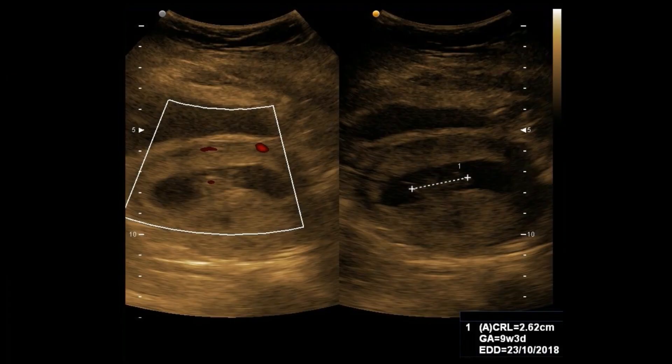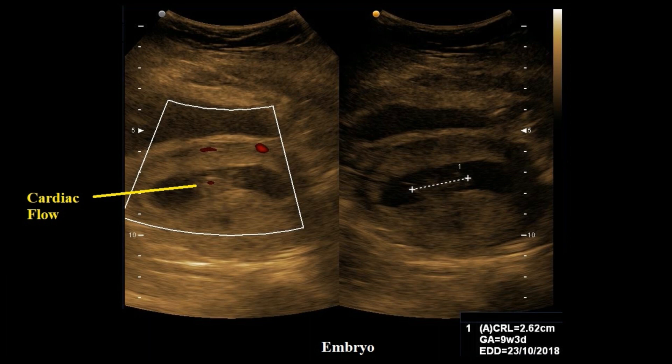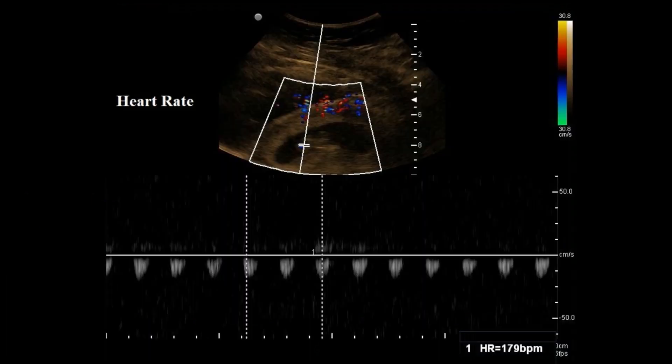This picture shows the 9-plus week sized embryo with cardiac flow on power Doppler. On pulse wave Doppler, the heart rate shows 179 beats per minute.